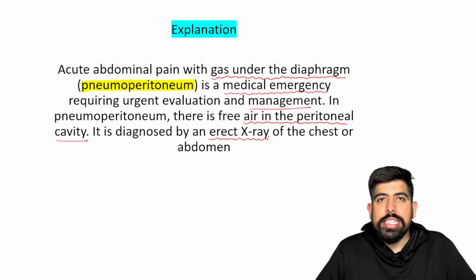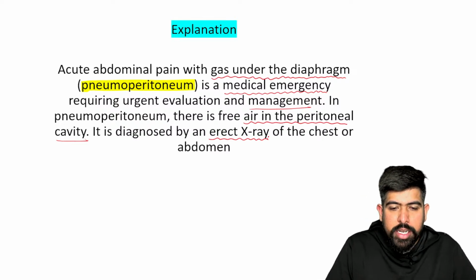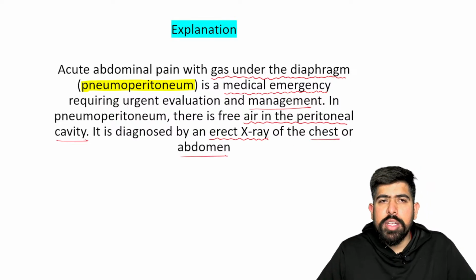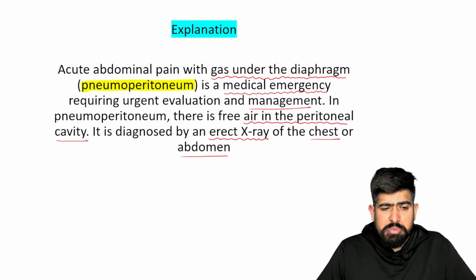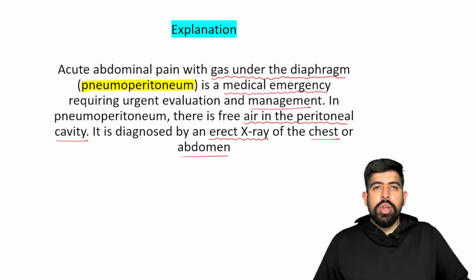And if on the X-ray the air is very minimal, so if not visible on that, we can do the NCCT abdomen also, right? So we are done with the chest X-ray and the abdominal X-ray, because the patient has shallow breathing also, so maybe there can be the possibility of pneumothorax also, right? So that's why we did the full study, right?